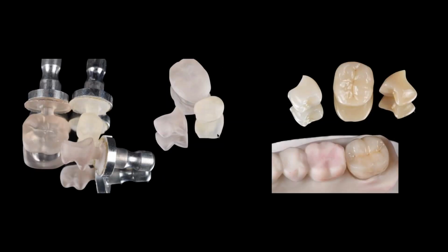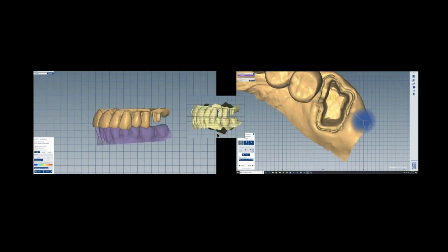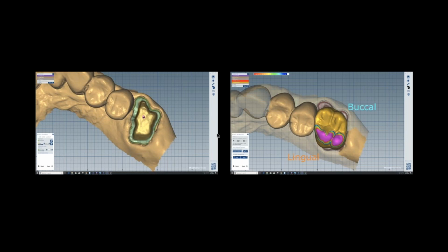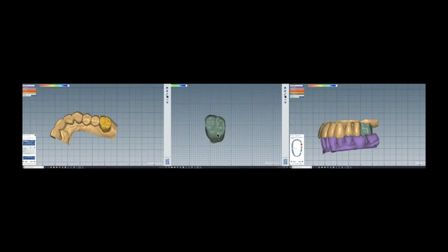I also love the ability that as I'm designing a cast, I can actually design a restoration, be that monolithic zirconia, which we do, or other materials like lithium silicates, which I'm a big fan of today. And I like the lithium silicates because as I'm making my designs throughout my system, I can imagine the space. I can go back to the face of the patient and look at the colorations, understand which material will work best here for the coloration.